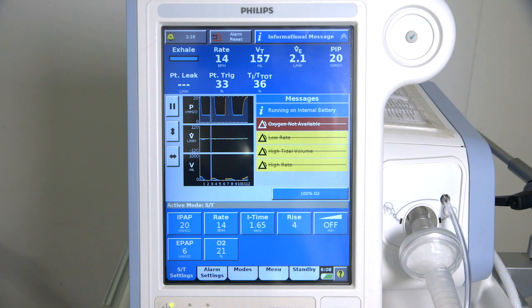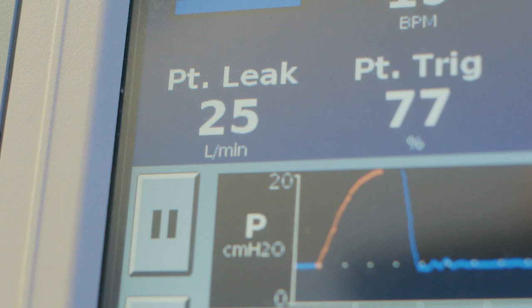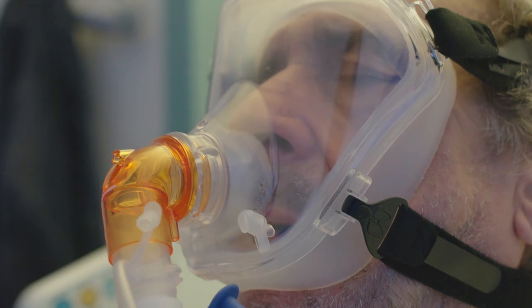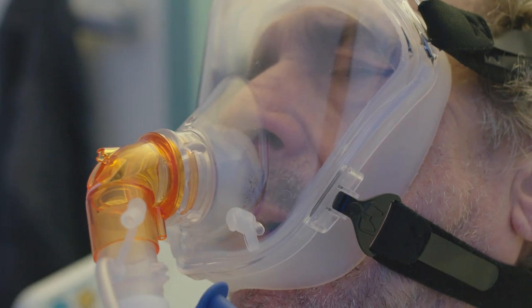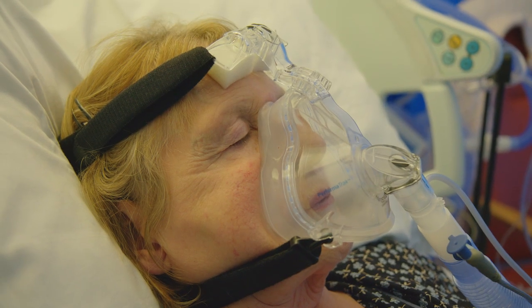At the top of the V60 screen, you will see all your patient feedback. A key feature is to look at the patient leak, which tells you the amount of leak from the mask. The machine can overcome some leak; however, if this is increasing too much, it is likely you're not ventilating your patient efficiently. No leak at all on the machine means the mask is too tight and you can loosen the straps. Too much leak — anywhere between 40 and 60 — means you're not ventilating your patient efficiently. Therefore, the mask may need to be readjusted, the straps readjusted, or a different size mask fitted.